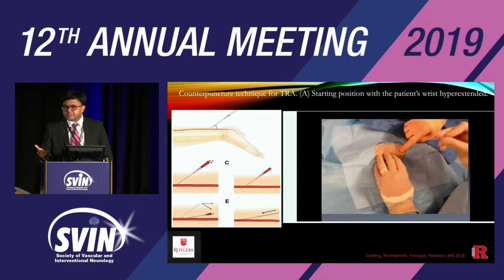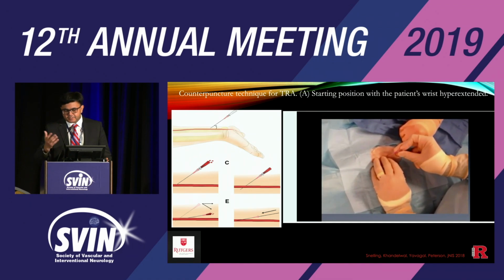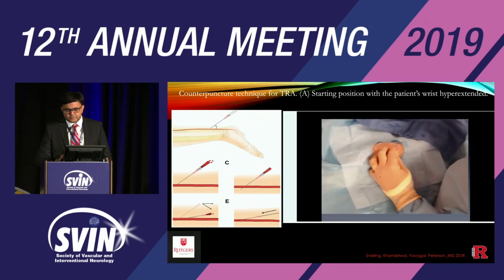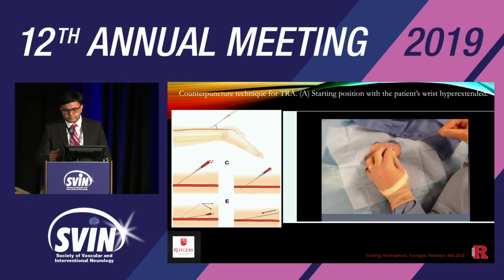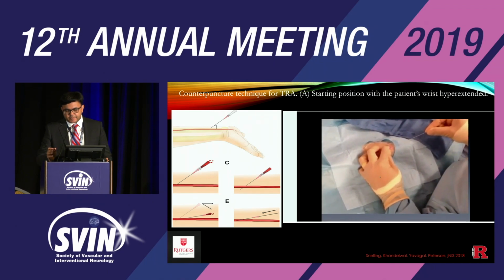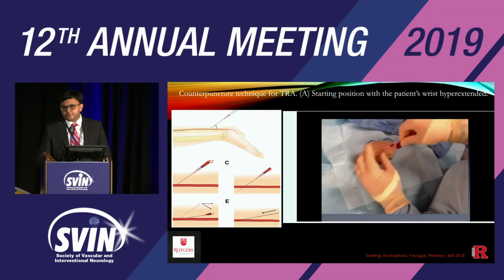And I use double puncture technique. Some people use single puncture. It's up to you, whatever you're comfortable with. So this is what we are showing. We use ultrasound, and for the purpose of video, we're just doing without it. And you see we puncture the artery. We're withdrawing the needle slowly. We're waiting for the flash to come back. And then as soon as it comes, you're in the middle of the artery, you thread your wire.